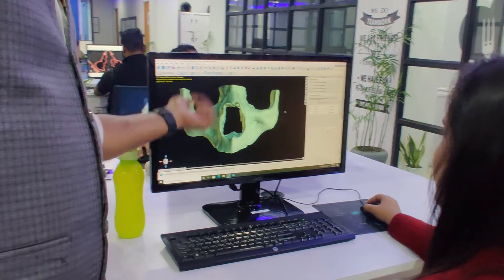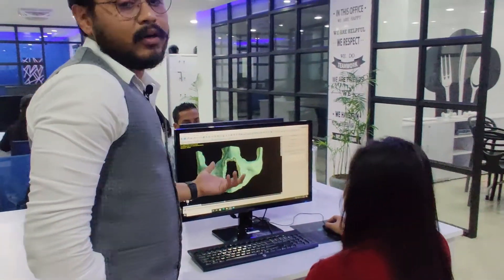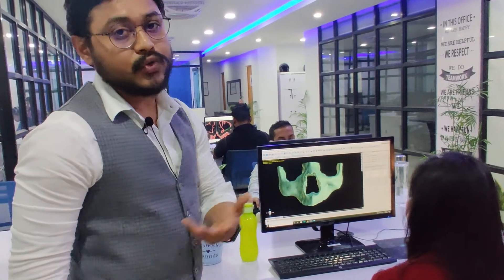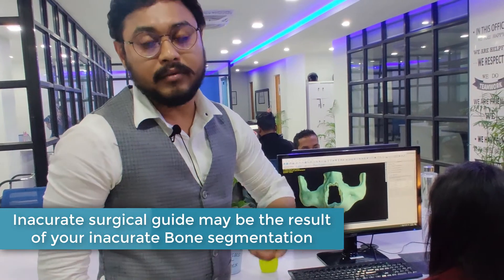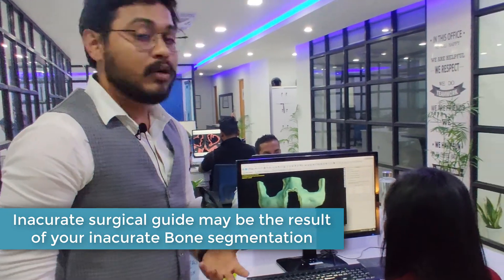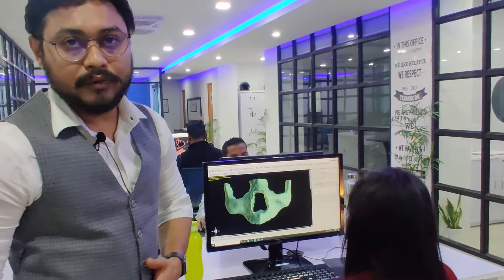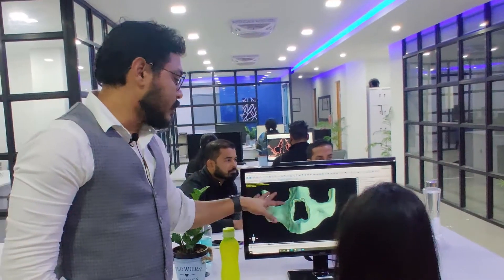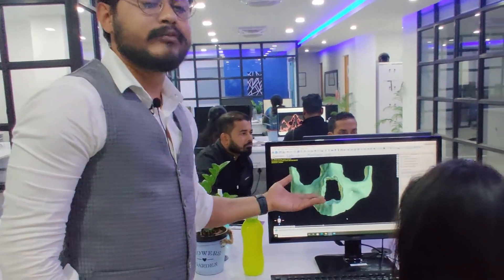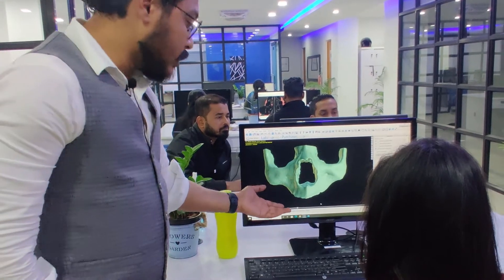If you are not segmenting accurately, the problem is that your surgical guide will not sit properly in the patient's mouth, or it will cause wrong cortical perforation, wrong-side perforation, or misangulation of the osteotomy. This bone model shown here has been segmented for zygomatic surgery planning.